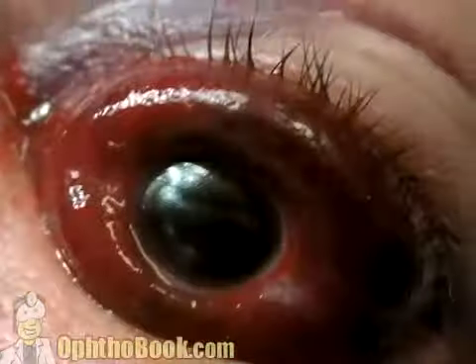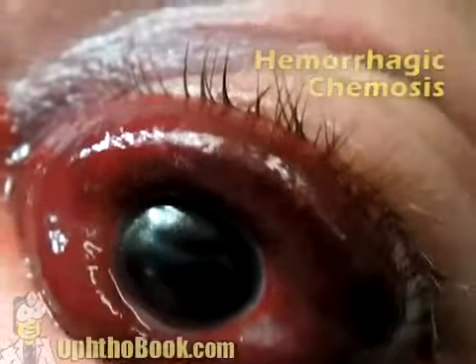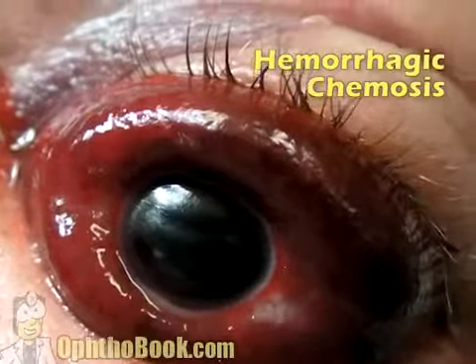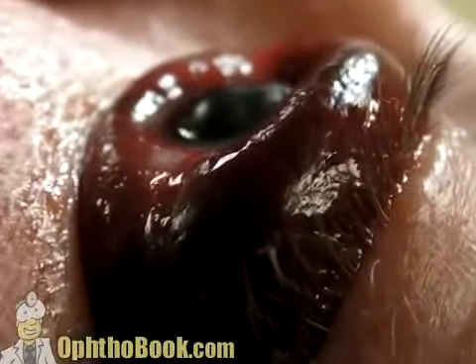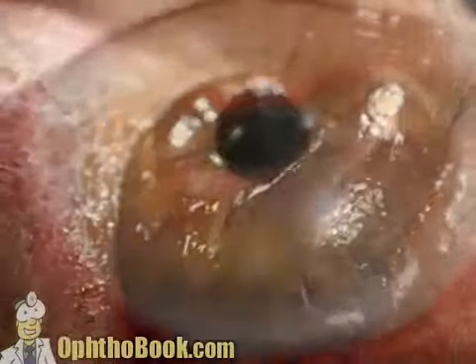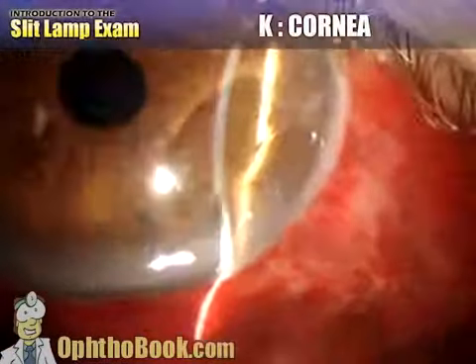It can look quite impressive, but this looks even more impressive. This is a hemorrhagic chemosis. This is actually blood under the conjunctiva that's bulging forward, and it's really quite impressive how far forward the conjunctiva skin can bulge. Moving on to our cornea.